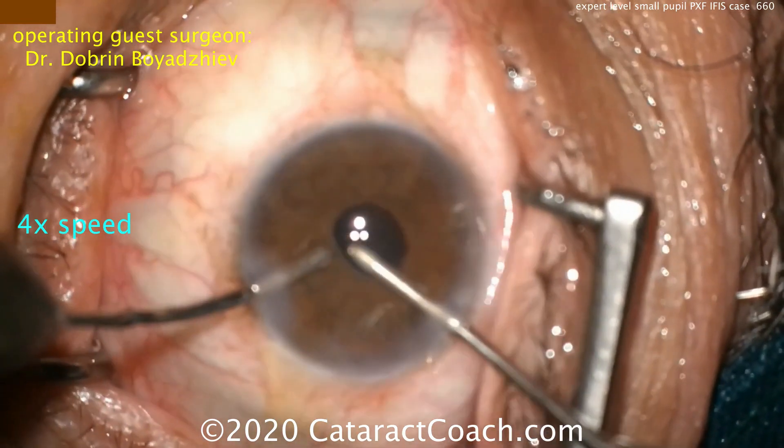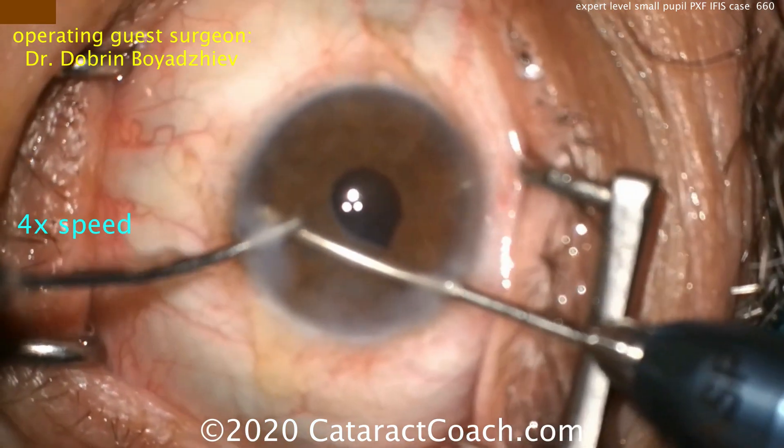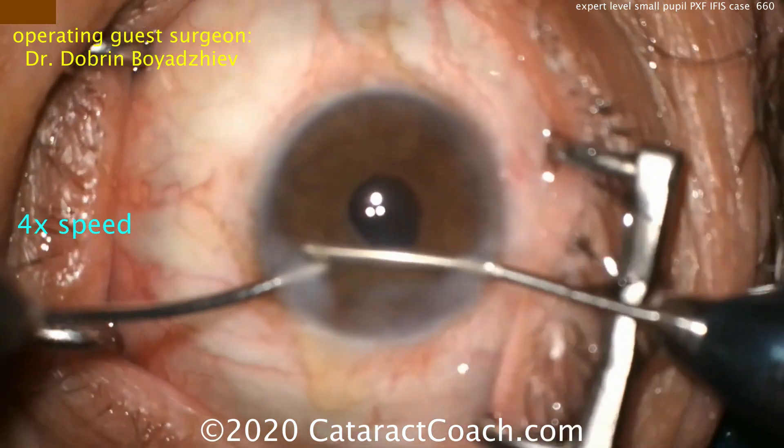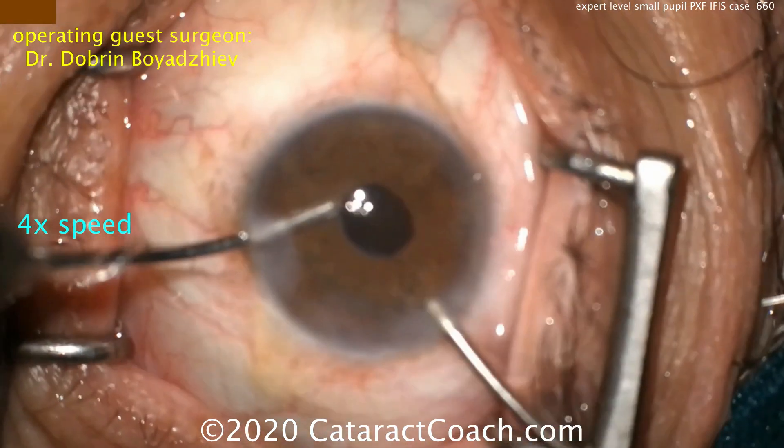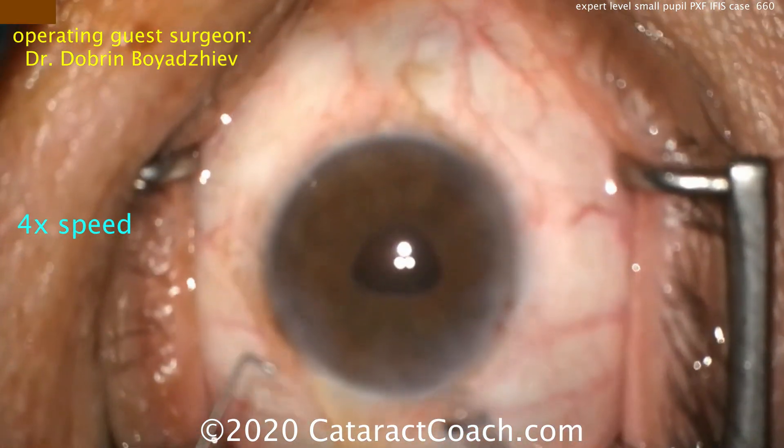Even the beginning surgeons — you don't have to try this. You may do a better job in this case by placing iris hooks or a pupil ring. If that's the case, by all means use what you've got — use what makes you comfortable.